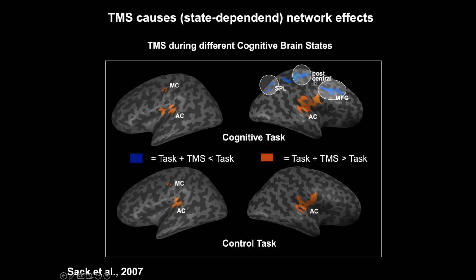So you always stimulate an entire network. That's in any case with every kind of TMS stimulation the case. Wherever you target the TMS coil, you will have a network effect that is comprised of cortical and even subcortical areas that react to your stimulation.